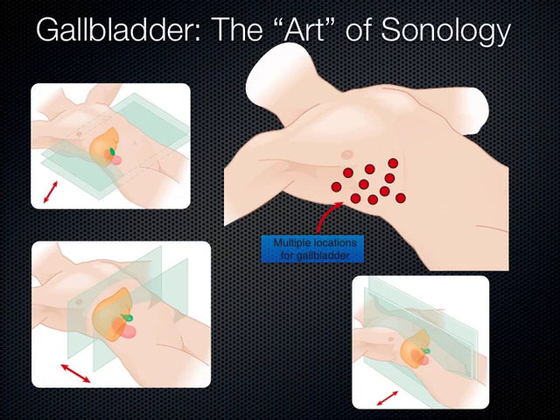And I've found the gallbladder all over the place, and sometimes in older patients, everything kind of sags down. I can see it down here. I found the gallbladder over here before in an older lady. So generally speaking, these are all the different locations you can dig around and find it.